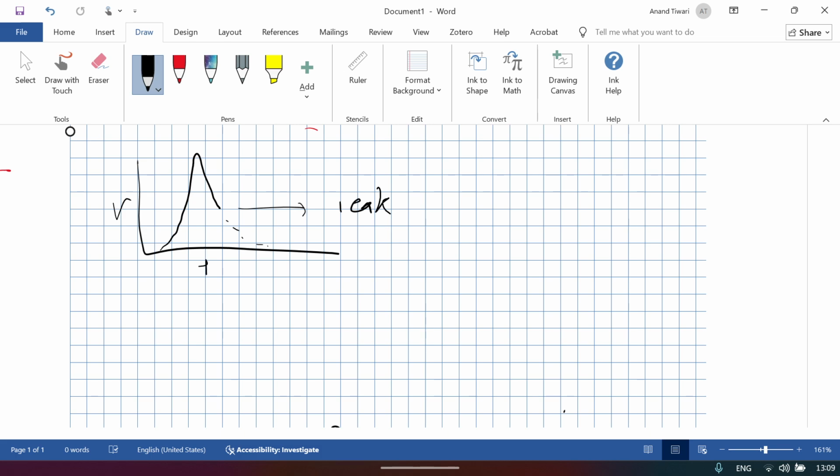Or if the peak alarm is set too high, the ventilator has a protective mechanism, and the tidal volume will not be generated because the pressures have gone too high.